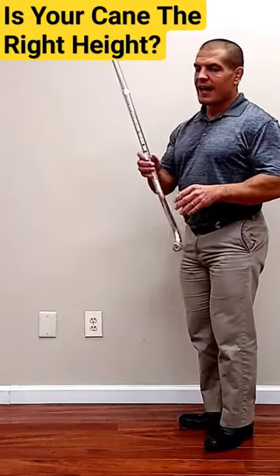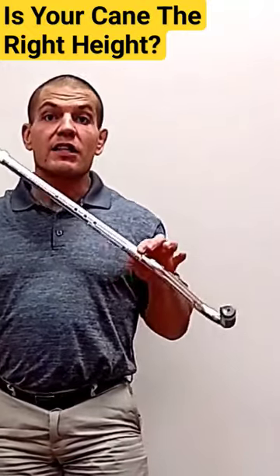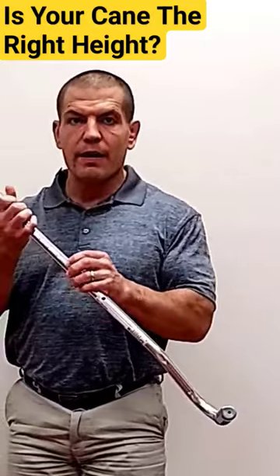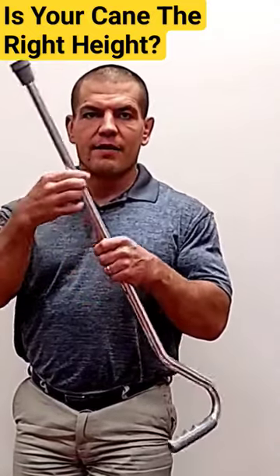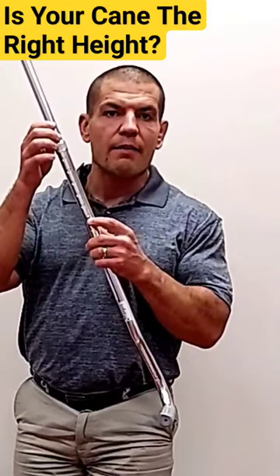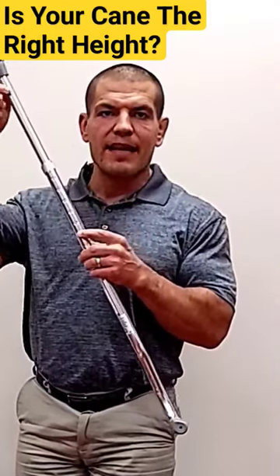To adjust the cane, I would recommend that you get an adjustable cane, not a one-size-fits-all wooden cane. You push the button in here, and most of them will have a little knob. You want to make sure that this knob is loosened up so you can adjust the cane up and down.